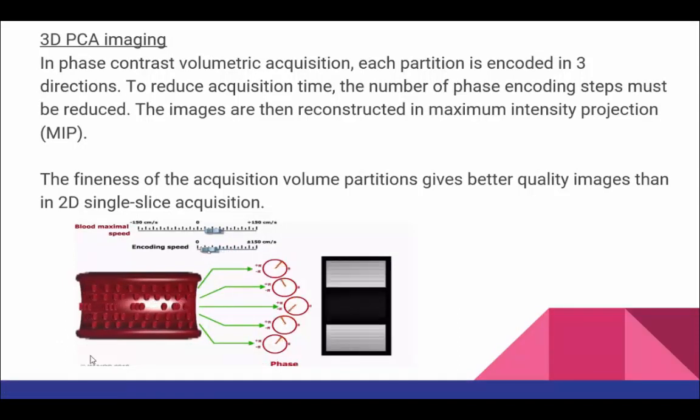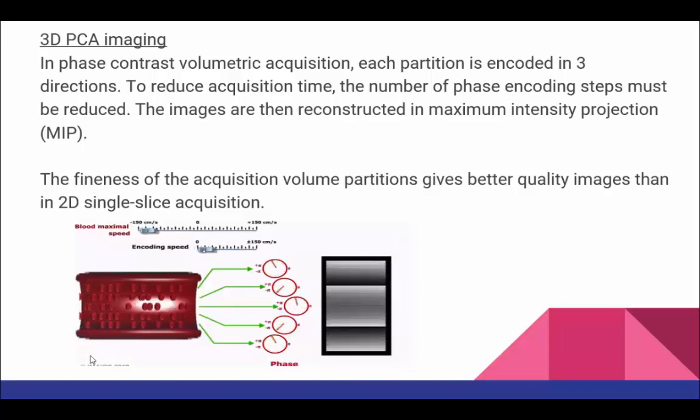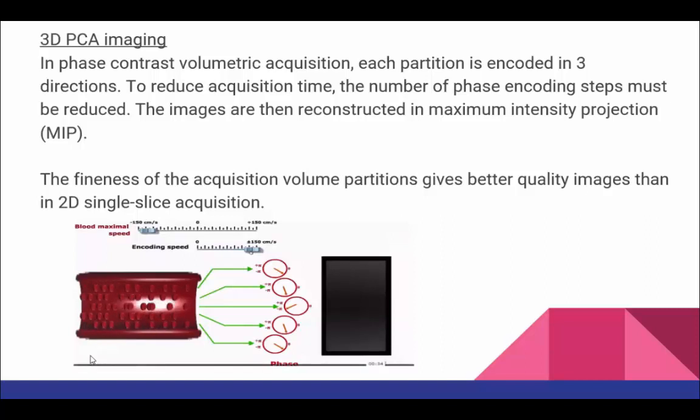Three-dimensional acquisitions are more time-consuming than two-dimensional acquisitions, and thus are used less frequently. Due to the long scan times associated with 3D acquisition, they are not commonly cardiac gated. Benefits of 3D acquisition include an inherently high signal-to-noise ratio and small voxels. High signal-to-noise ratio is due to the effective averaging of signal that is acquired throughout the entire scan. Small voxels are due to the encoding methods employed.